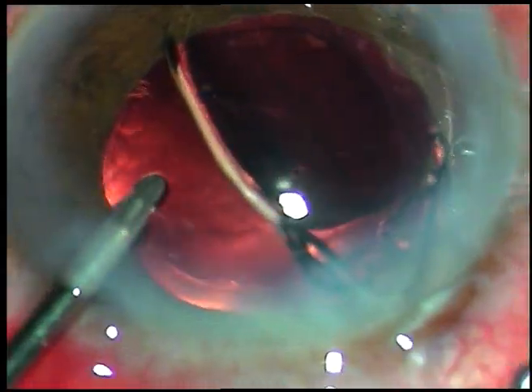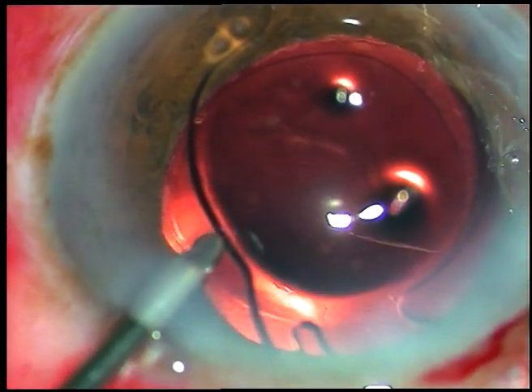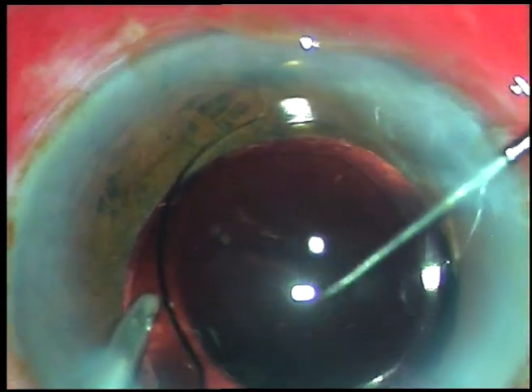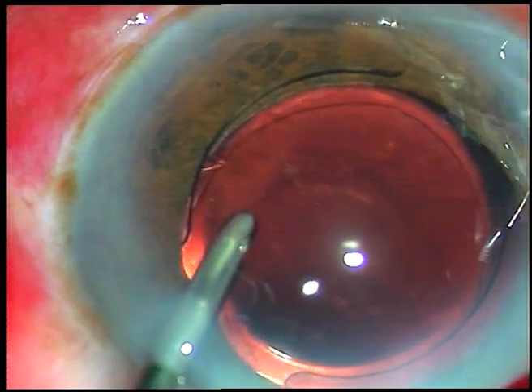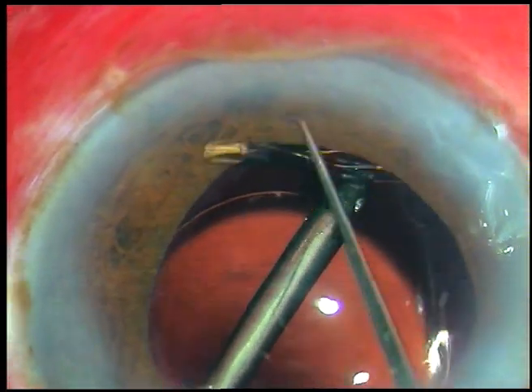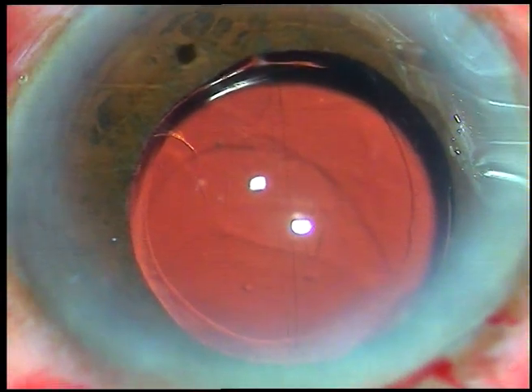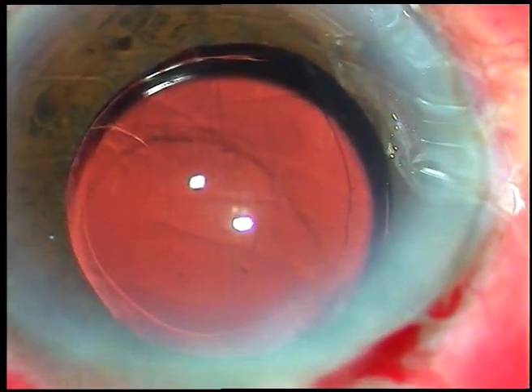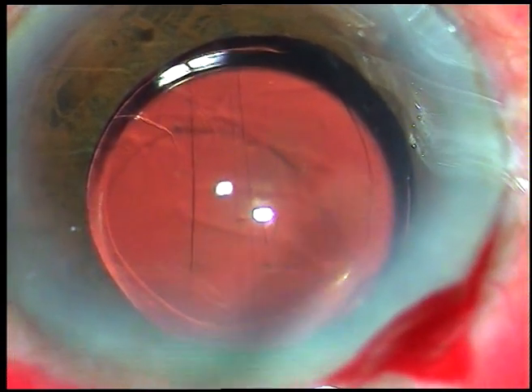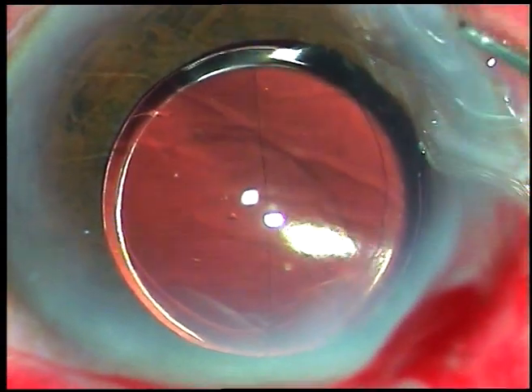Now I place the lens over the iris. Keeping the anterior chamber formed, I use a Sinski hook and place the haptic gently in the capsular bag. Now I place the other haptic in the capsular bag, and see — the rent has not increased in size. This is a good technique if a PC rent occurs during polishing of the posterior capsule; we can place an IOL like this so that the rent doesn't increase in size.